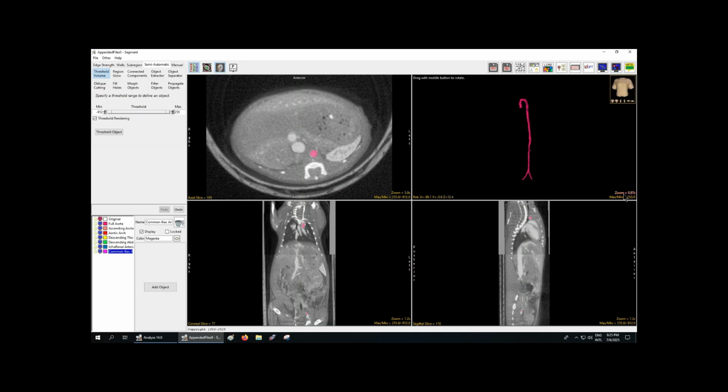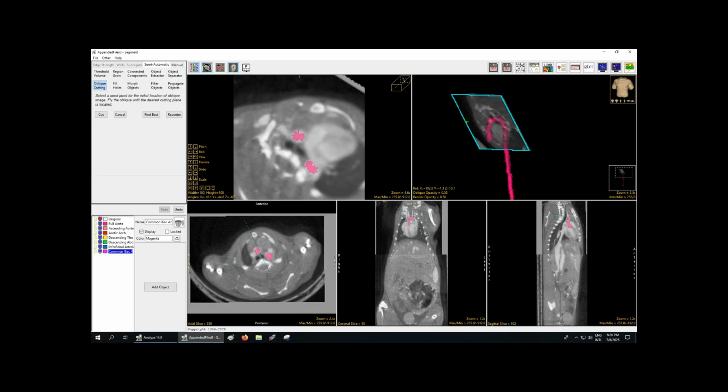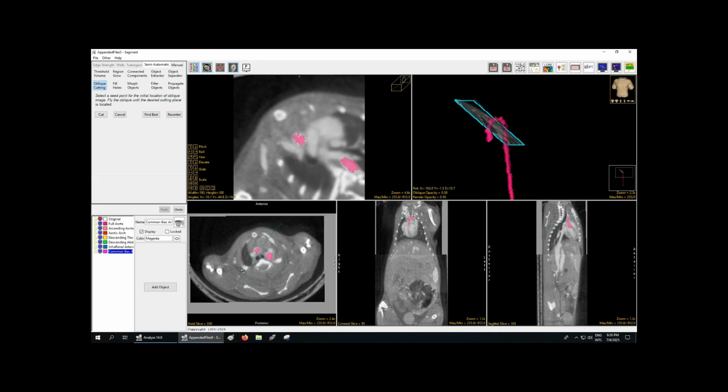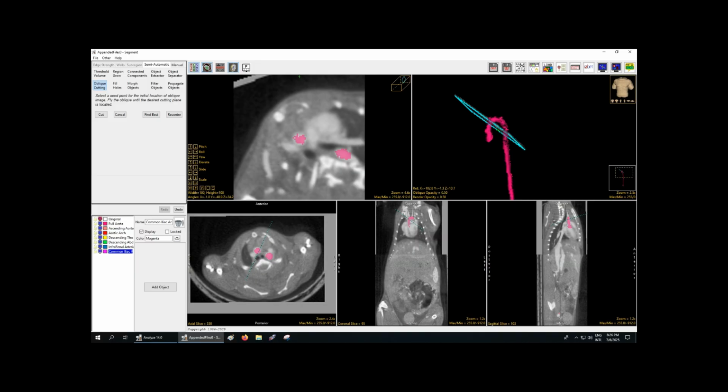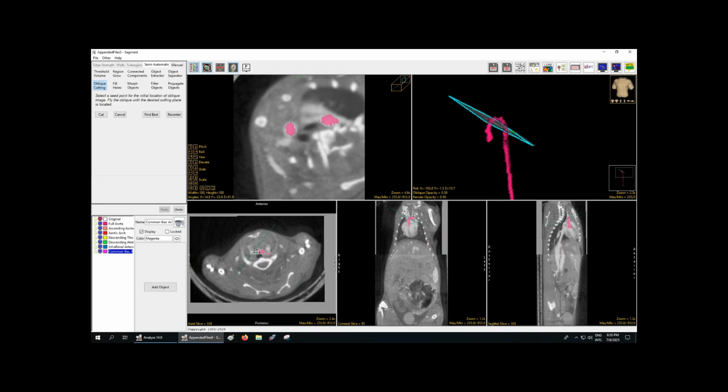We are going to split these up through 2 different methods. First of all, for both the ascending aorta as well as the descending thoracic aorta, you'll be dealing with the arc, and that is quite annoying. Before that, thank God, Analyze Direct has a very nice function called oblique cutting, in which you can place cuts across different regions and make sure they're totally aligned. There we go. And I'm going to place this right before the brachiocephalic splitting.